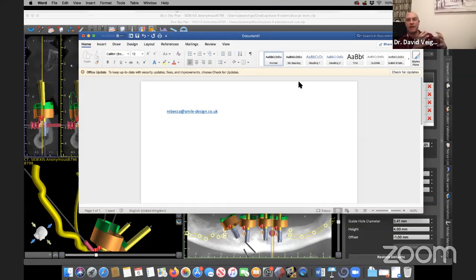Yes, bone is different in each arch. If I have really soft bone in the maxilla, I underprepare the osteotomies and allow the implants to produce the osteotomy for me. For instance, if I'm placing a 4mm implant, I might only drill that site in the maxilla to a 2.2 or a 2.5, and let the implant cut its way and create the site itself.